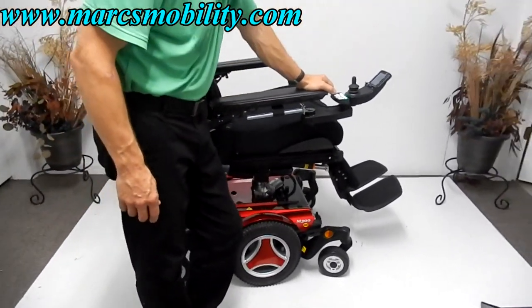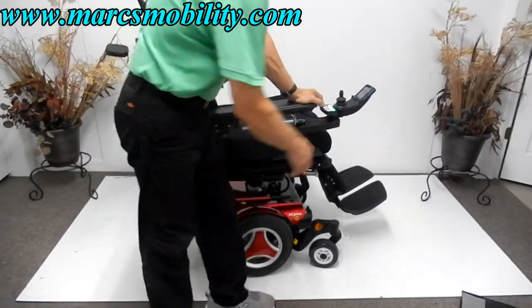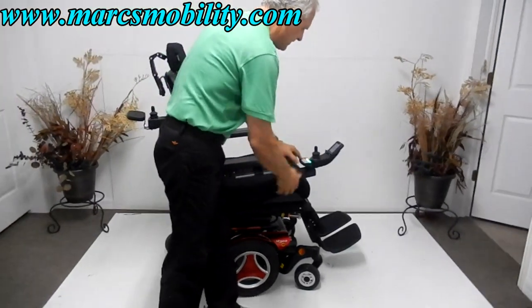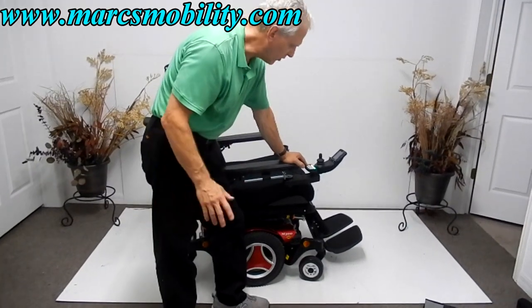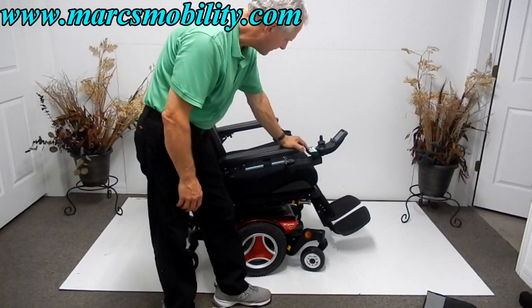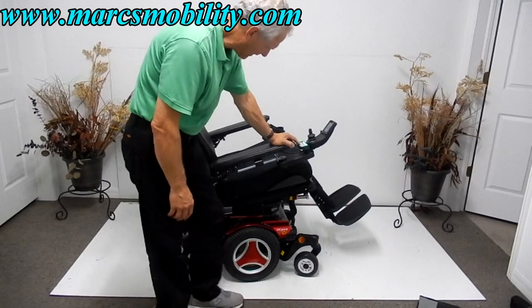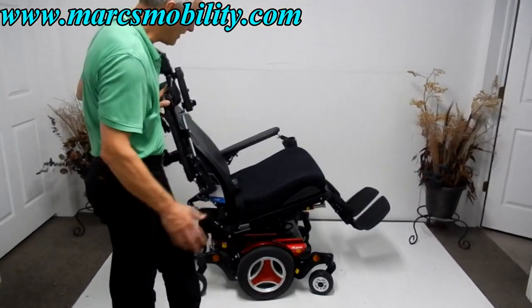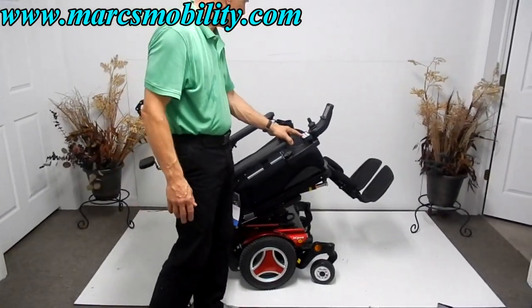Now I'm going to bring the seat lift back down and cover the electric tilt next. You do have a swing-away joystick like most of these expensive chairs — you can put the joystick on the right or left side if you're left-handed, no problem. The arms move completely out of the way for easy exit and entrance. This is your electric tilt right here.